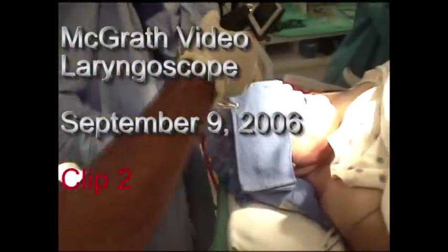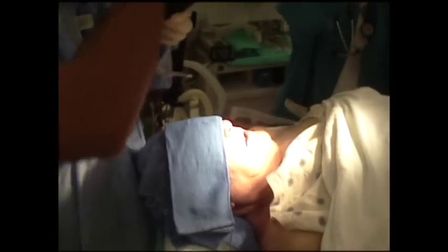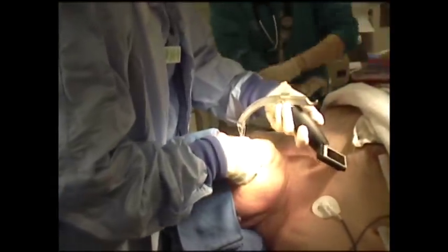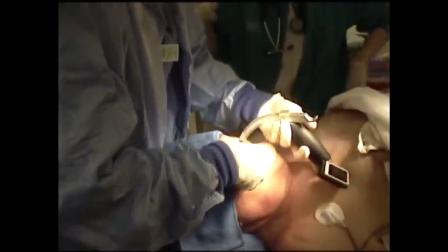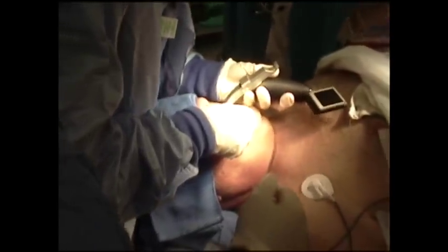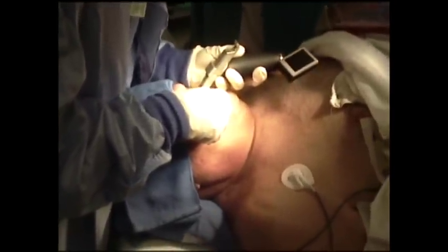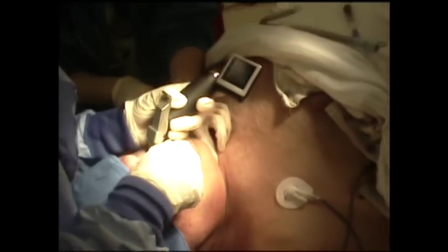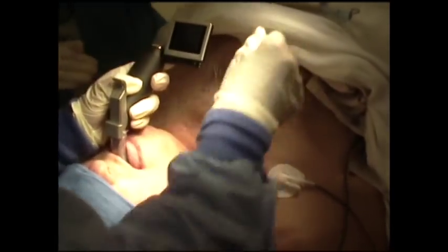I'm going to slide this in a little longer. Just right here on top — go ahead and flip that on. You just don't want to go too deep. Do you have it on? Yeah. Oh, there we go. Got the bougie. There we are. Look at that. Great picture.